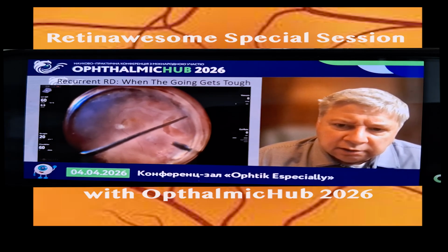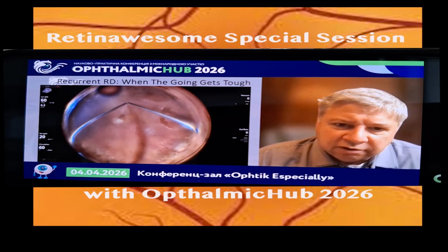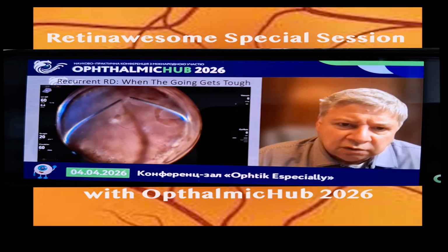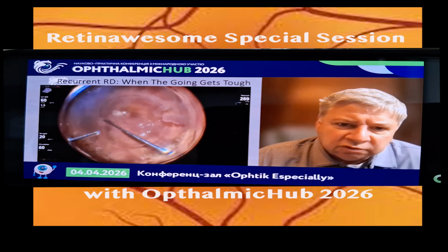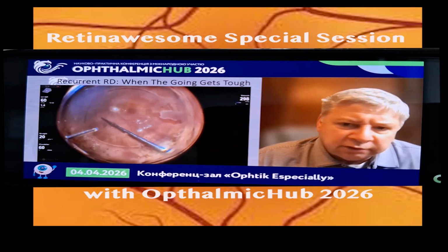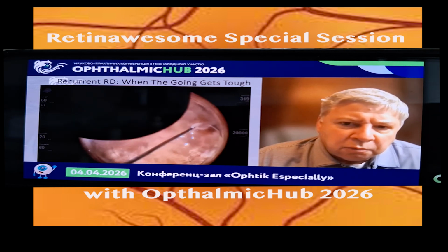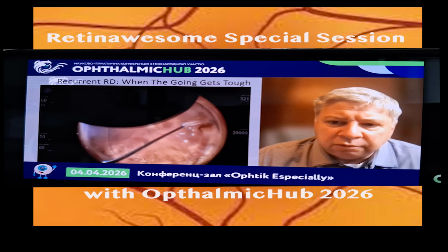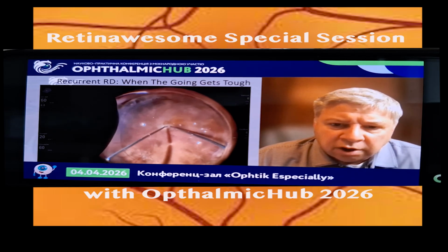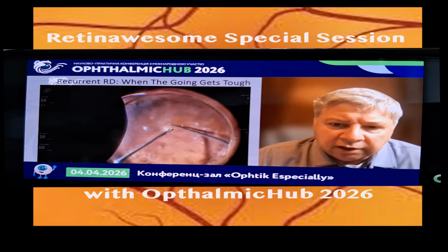And you always want to cut more of a patch graft than you think you're going to need. I think we're doing this 27 gauge, so rather than using a scissors, I'm just using the cutter to cut the patch graft. I was peeling some inferior membranes, putting in perfluoron. I really like perfluoron because if the retina goes flat under perfluoron, it's going to tend to stay flat.